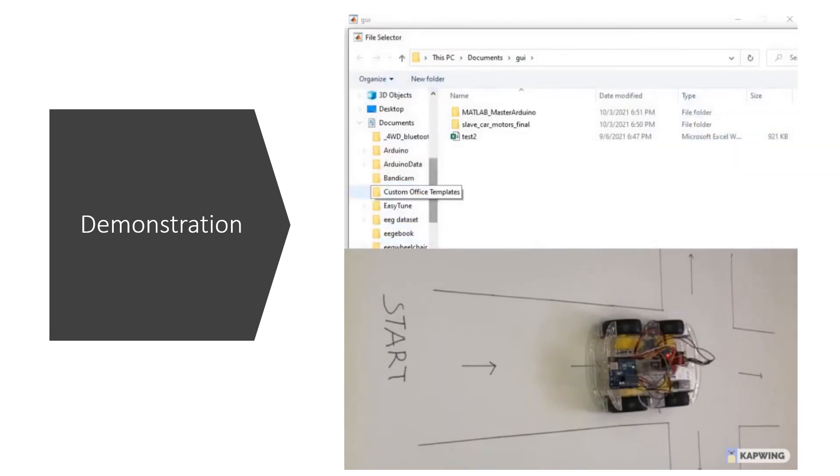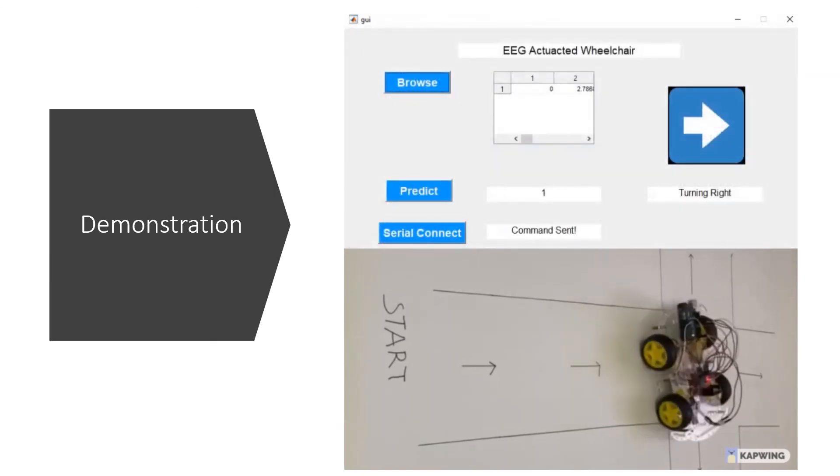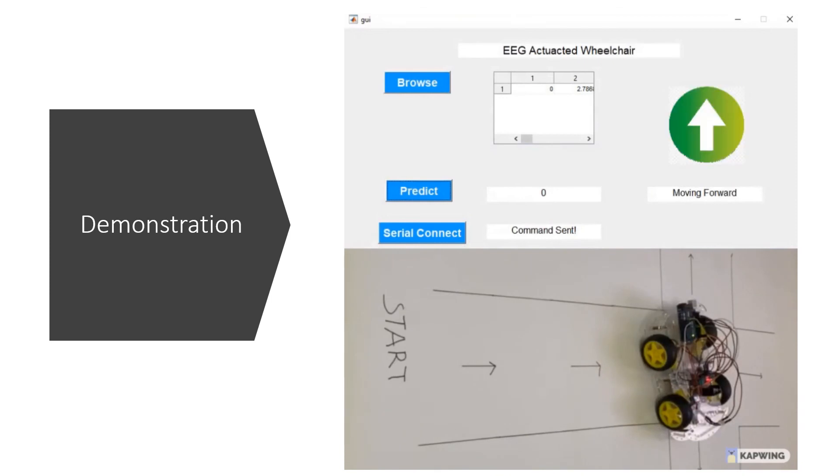And then we want to move further again, we will be using the class 0 again. We will use another dataset. As can be seen, the wheelchair has already reached its destination.